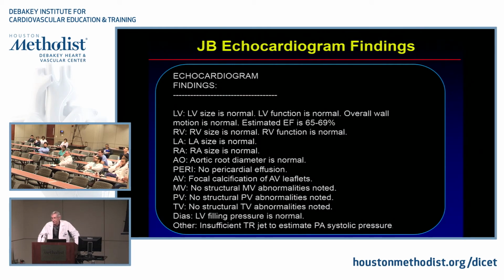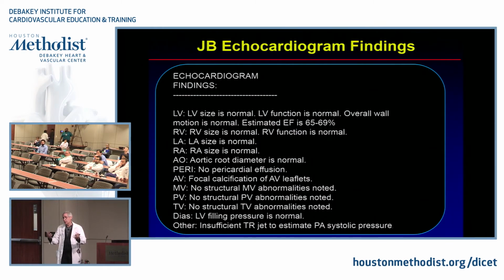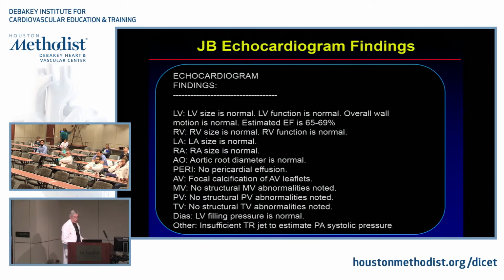Yes, John. Is there any validation data for looking at the distal vessel like that to say whether the outcomes are better? You know, there are some data looking at chronic total occlusions, but it's very preliminary data. We've been looking at this quite frankly all along, because CT is such a robust way to look at collateral blood flow because of the equilibrium phase and the fact of the surrounding tissues. But it's something that requires more publication because there really isn't a lot of data out there yet. Yeah, it would be a good project for a fellow actually to look at that.